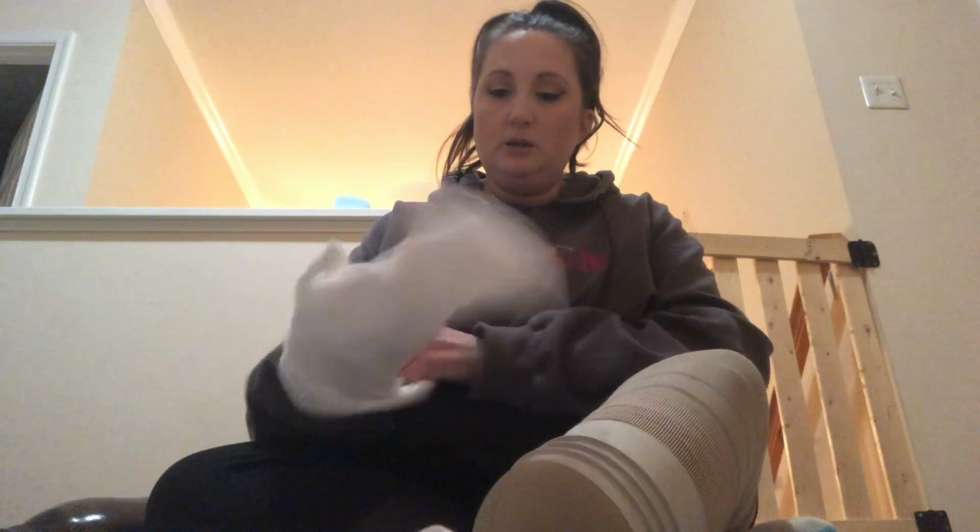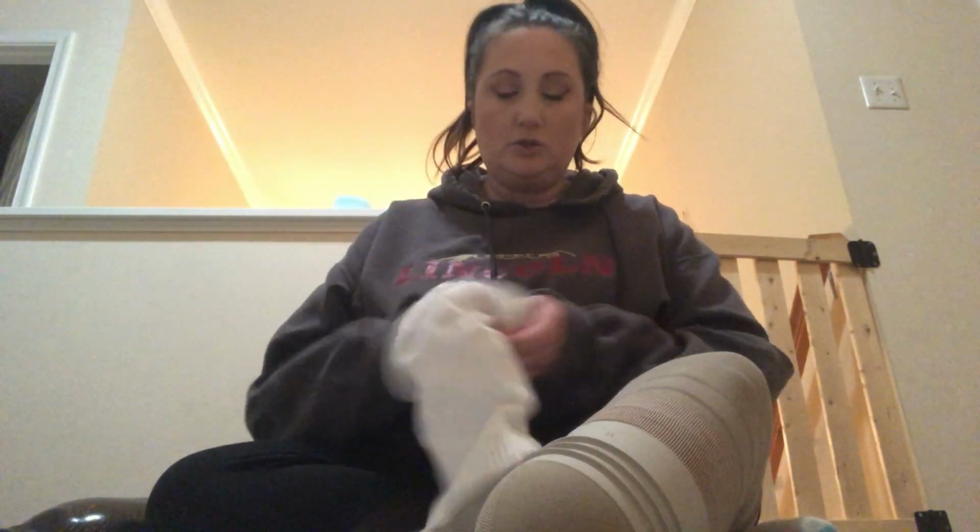So I am going to keep the ring on the sleeve and only add socks to the upper part of my leg. We're gonna see what happens. So this is a 3-ply, and this is a 3-ply, and this should have been my first clue. This was one of the socks that he sent me home with that he didn't have one that was open at the end, so he cut it. And at the office, I was thinking, why would he cut that? That's weird.